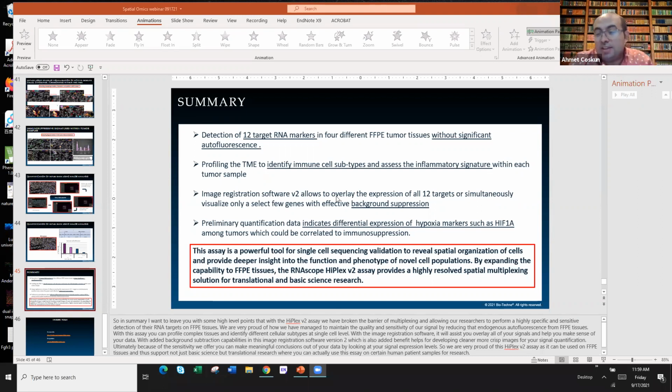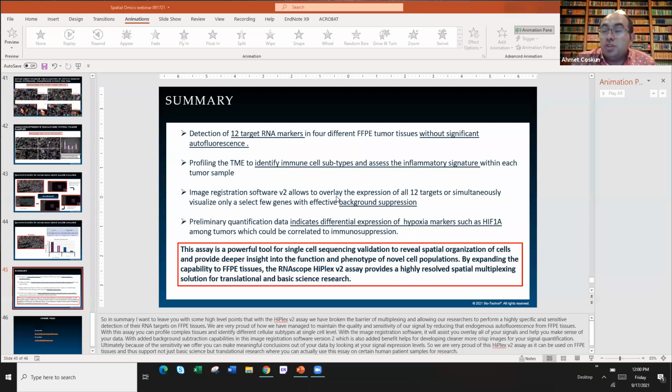I think in the field, I think you're right. Even in the imaging data, there are these challenges of where you really set your threshold, because there's still some non-specific things going on in the tissues and samples.